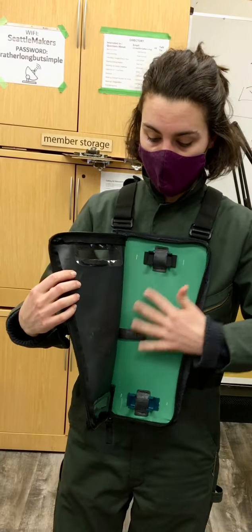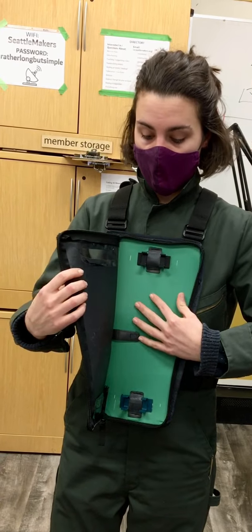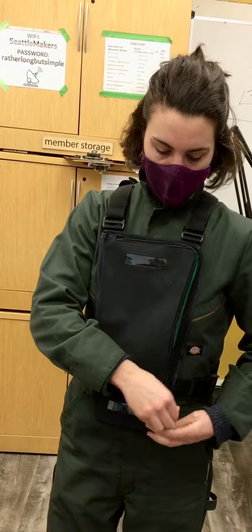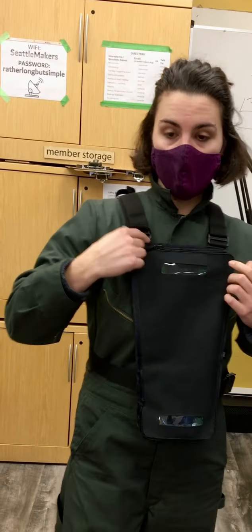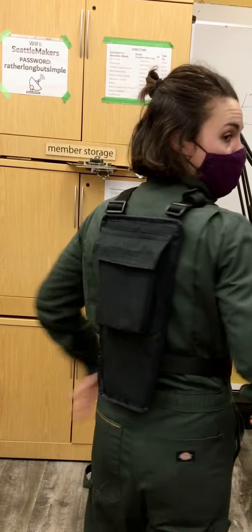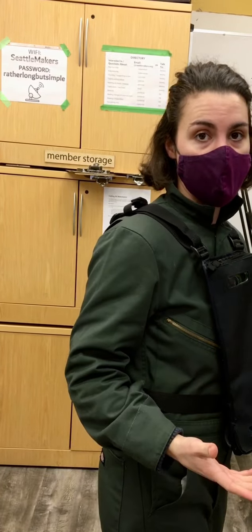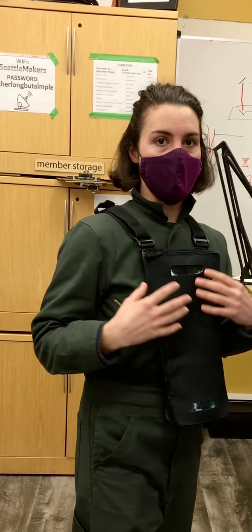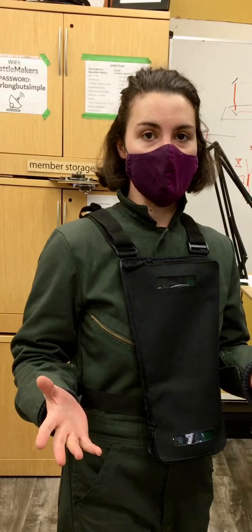Then you'll have your wires and whatnot safely in here. You can zip this bad boy up and the wires go over the shoulder back into here where you have all the electronic components like the power bank and computers that make that wonderful technology happen.